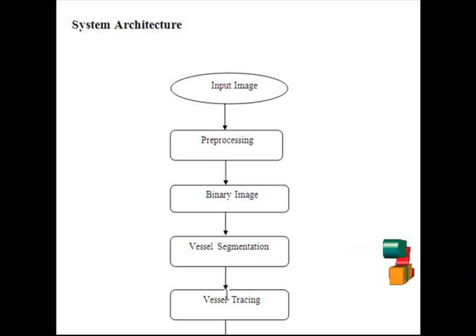GP consists of disconnected subgraphs that are independent and can be processed in parallel. Without loss of generality, we refer to each of the subgraphs as the segment graph GP. The goal is to obtain a set of binary trees from the segment graph such that each binary tree corresponds to the vessels in the retinal image. Then finally we plot the traced vessels in red and blue.